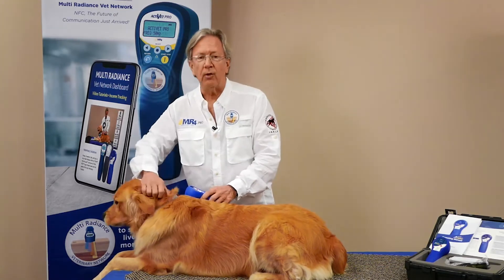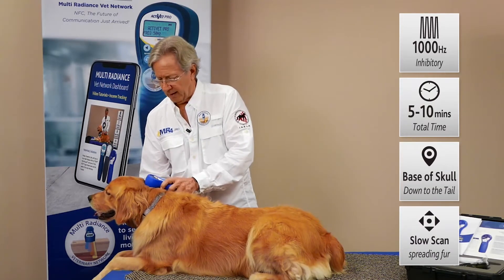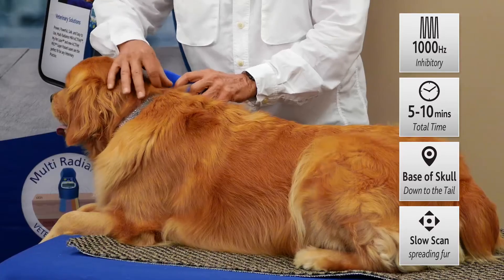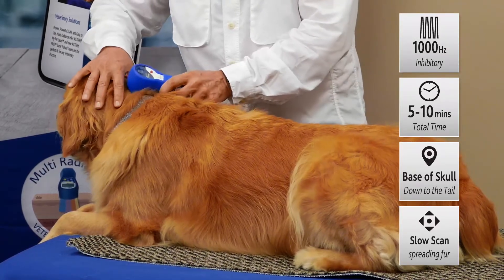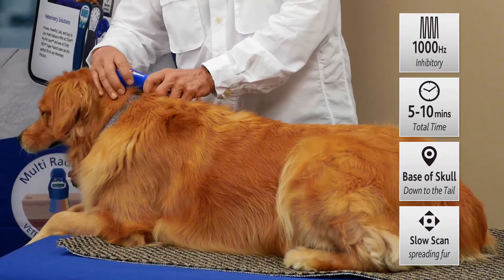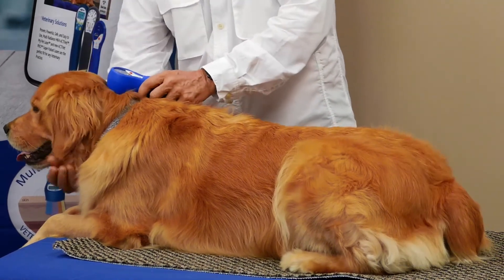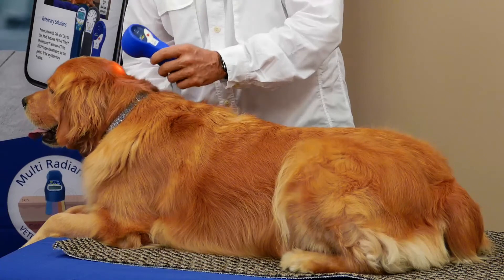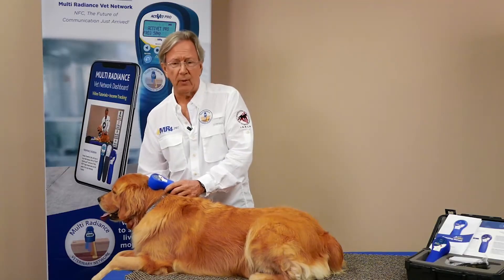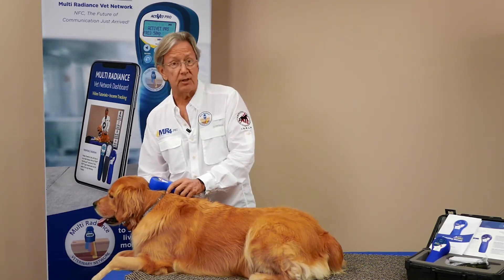We'll turn on the power and start with our unwind protocol along the spine, beginning right up at the base of the skull, moving the laser at about a centimeter per second. With a thick-coated dog like her, we can spread the fur to get the laser down to the skin surface for maximum penetration. The visible red is 660nm, there's broadband infrared, and the super-pulse laser itself is 905 nanometers — all three wavelengths working synergistically to get through the collagen and into deeper tissues.